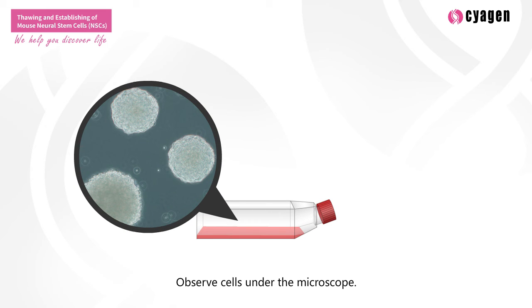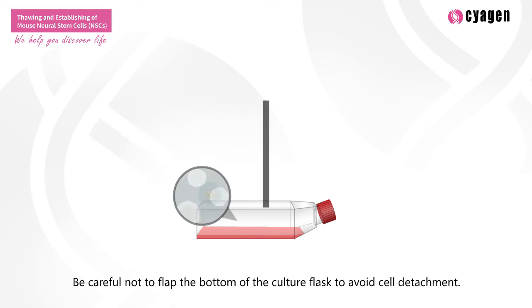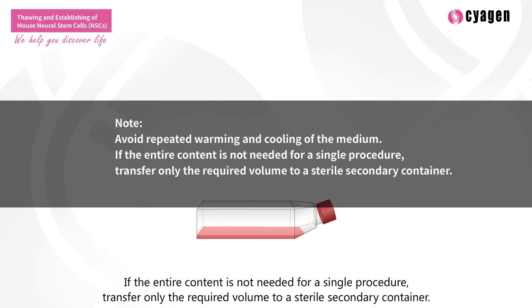Observe cells under the microscope. Be careful not to flap the bottom of the culture flask to avoid cell detachment. Note: avoid repeated warming and cooling of the medium. If the entire content is not needed for a single procedure, transfer only the required volume to a sterile secondary container.